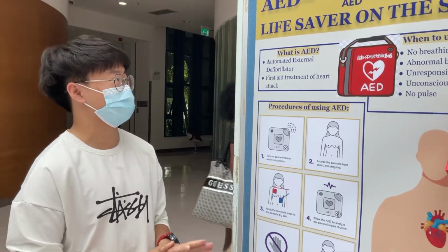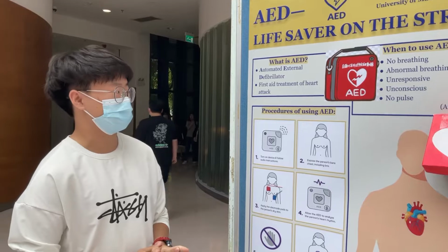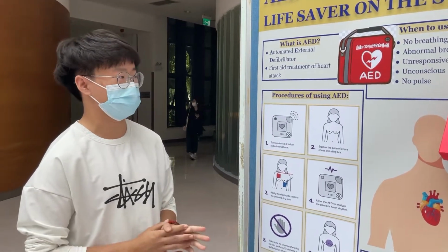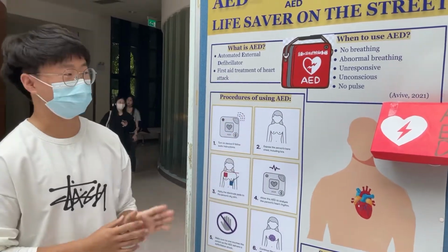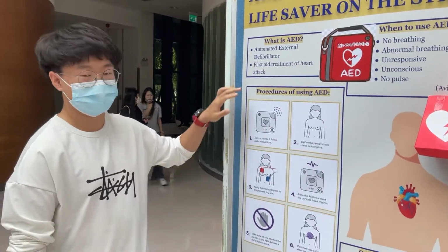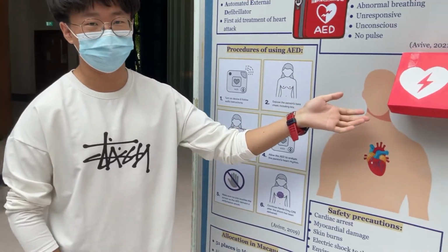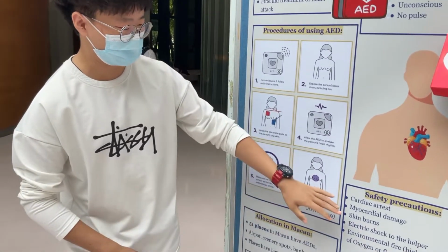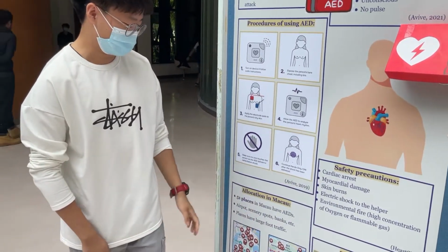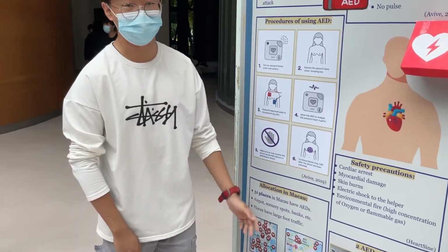The subject of our poster is AED, a lifesaver on the street. AED is used for the first aid treatment of heart attack, and we list some conditions to show the audience when to use AED. This is the procedure of using AED, and we also set a model to show the audience how to use it. And these are the safety precautions, and what's more is the allocation of AED in the city, and also the AED in our campus.